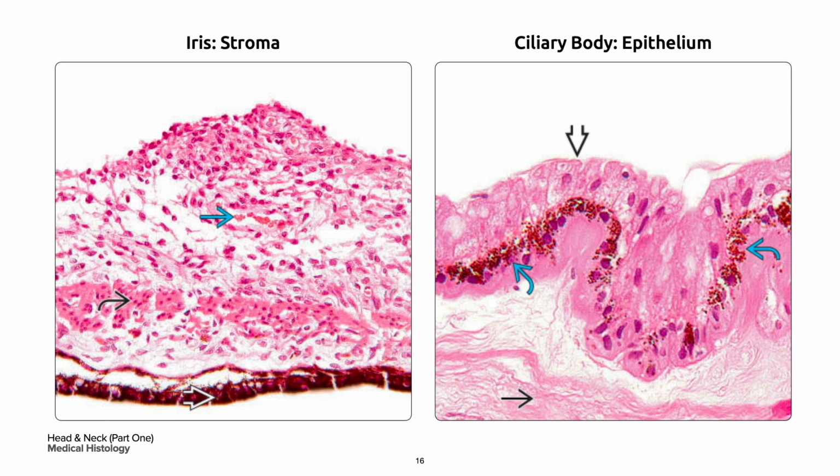On your left is an iris, which is composed of connective tissue, smooth muscle in curved black arrow, blood vessels in single blue arrow, nerve cells, and melanocytes. The number of stromal melanocytes determines the color of your iris. The posterior epithelial lining is heavily pigmented in white bold arrow.